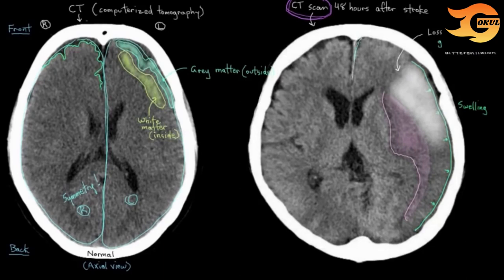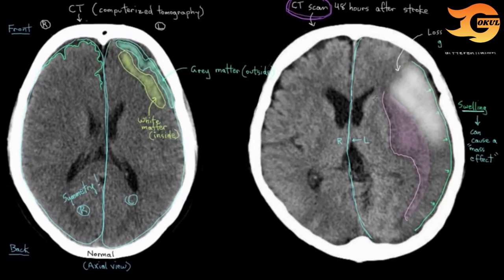Another sign is the disruption of left-right symmetry. In the stroke brain, you can see there's some bulging of the left side over to the right, caused by swelling — this is referred to as a mass effect. This is an extra bad sign because it can cause compression of other parts of the brain and can be fatal. You can already see an example of this mass effect with the swollen area pushing on and reducing the volume of the brain ventricles, which produce your cerebrospinal fluid — your CSF — that bathes and nourishes your brain.